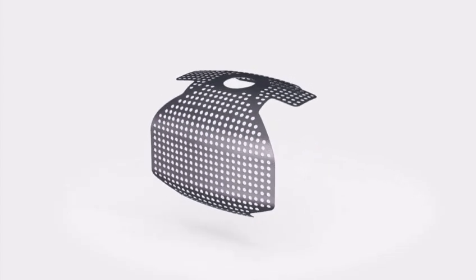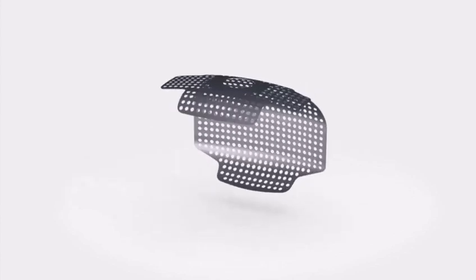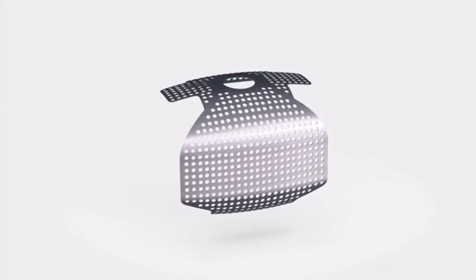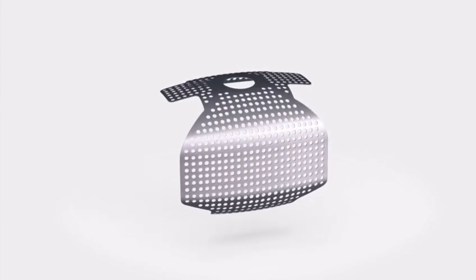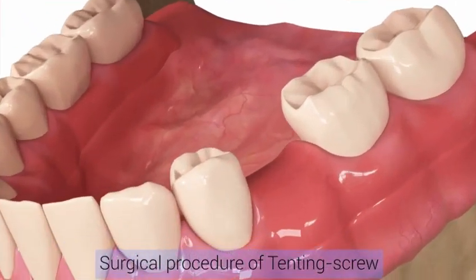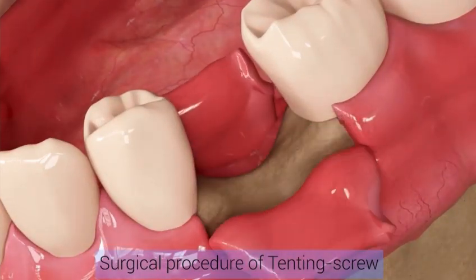Start by using a gauge to measure the horizontal and vertical bone defect to select the right type: 1-wall for buccal area defect, 2-wall for buccal and proximal area, and 3-wall for buccal, proximal, and lingual side bone defect. Then select the proper tenting screw length based on the vertical bone defect.